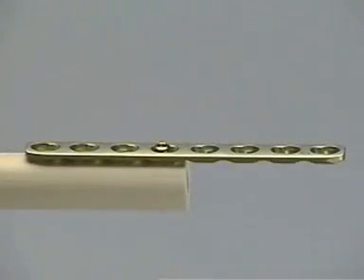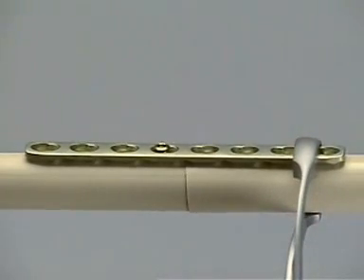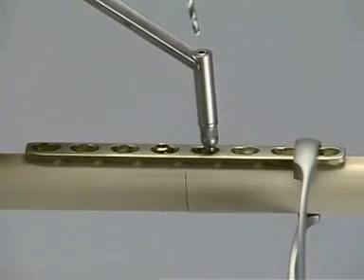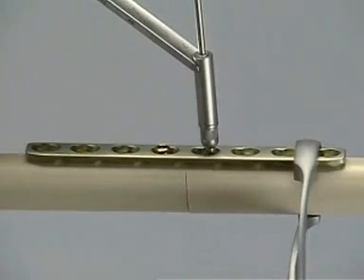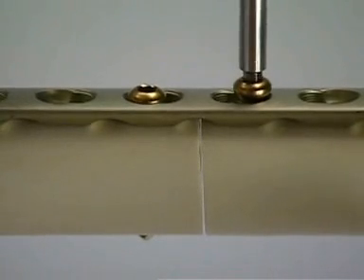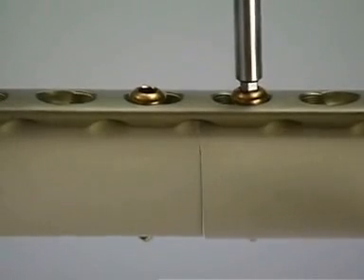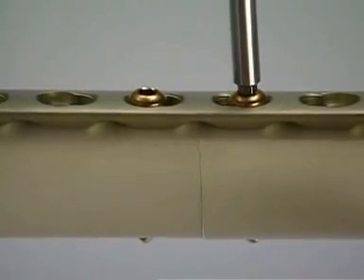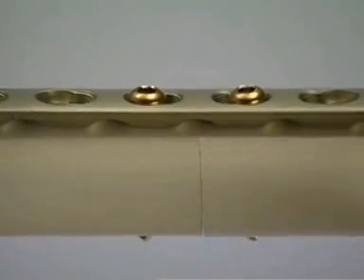The second half of the bone is reduced and fixed to the plate with the bone-holding forceps. Without applying any pressure to the universal drill guide, a 3.2 mm eccentric hole is drilled. The length is measured. When driving home the screw, the head hits the smooth slope of the plate hole and the bone is moved axially, creating compression of the osteotomy. However, this compression occurs only beneath the plate in the near cortex, while a slight opening of the osteotomy in the far cortex can be observed.